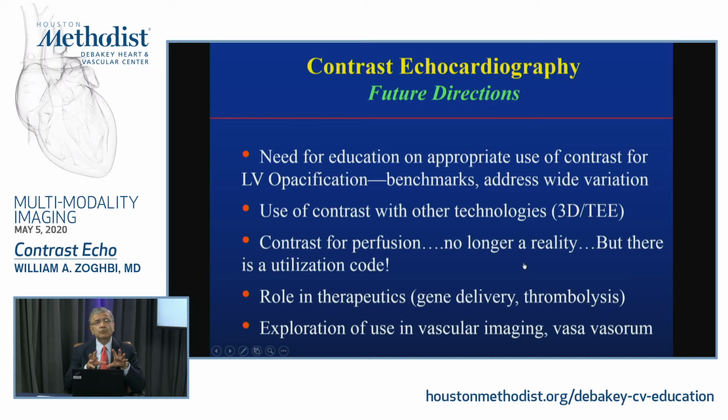I think that would be important to enhance its utilization and optimization in those areas where we use 3D to assess, hopefully with automation, ventricular size and function, so 3D volumes and function, and maybe see where we could use it in strain imaging. And I haven't seen much of that, so if many of our colleagues in the industry are watching, these are the two areas that we could use with 3D, even with 2D for strain imaging.